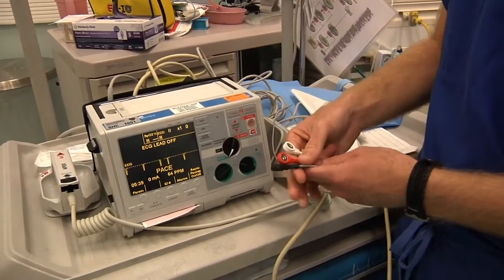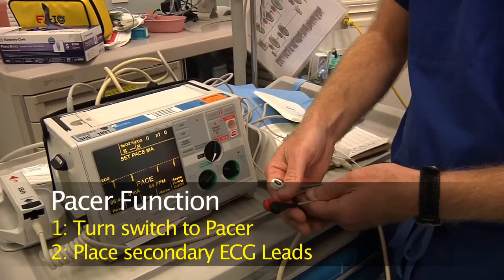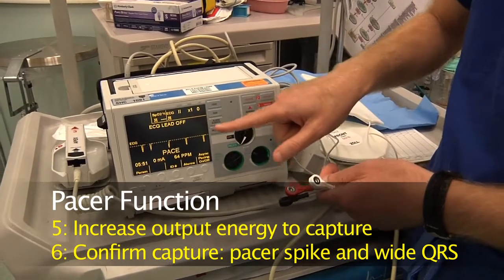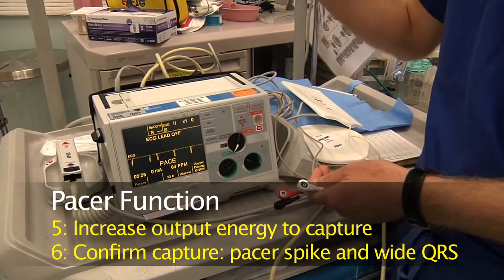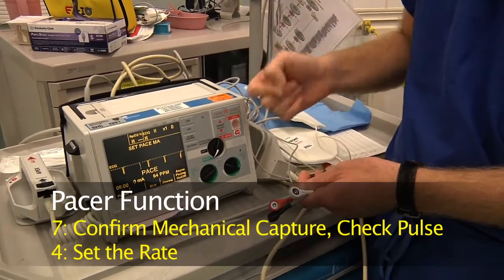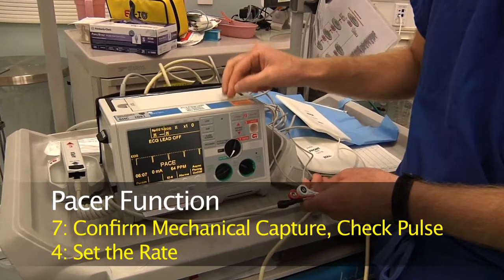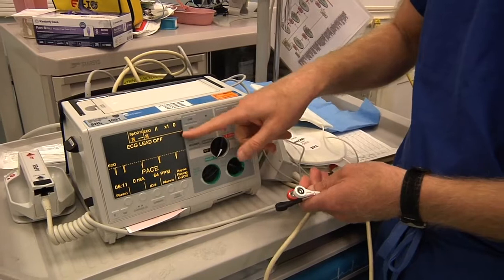So the setup for a pacer: turn on to pacer, leads on, pads on, set the rate, increase the milliamps until you get capture. And how you'll know you have capture is that you'll see a pacer spike and then a wide deflected QRS. Now that's an electronic capture. Now you need to confirm mechanical capture by checking the pulse. Just because you have pacer spikes with capture doesn't mean you're actually getting cardiac output. You actually need to feel for a pulse. So those are the important points about the pacer, the defibrillator, and the ECG monitor.